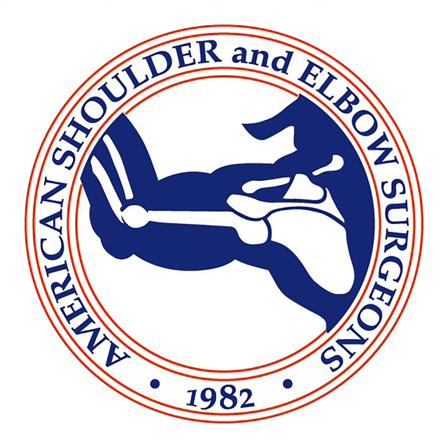I'll usually do two triple loaded anchors, and within each anchor, I'll pass one suture as a mattress, and then bring the other two limbs as simple sutures, medial to the mattress suture, so like a Mason Allen configuration. So I'll do an anterior anchor and a posterior anchor, triple loaded with a Mason Allen configuration to get the tendon back down. And then I'll kind of measure the box that I want to cover with my dermal allograft and then cut it free.